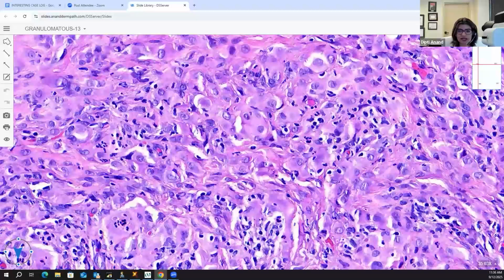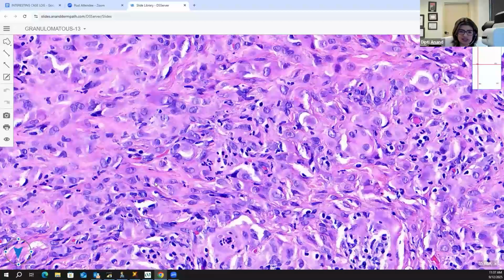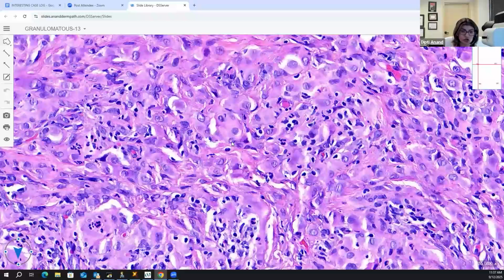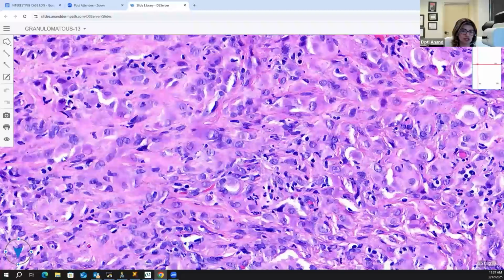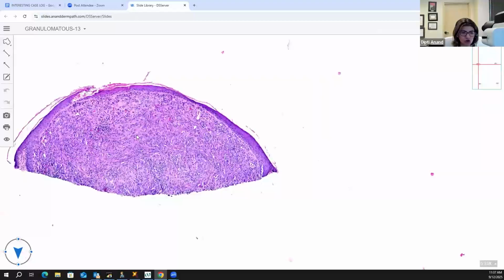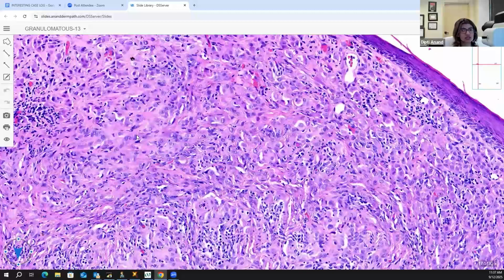These have very nice cells, and they are not really multinucleated. They are more like binucleated. Maybe they may have three nuclei, but they're not big multinucleated like the xanthogranuloma. And then this is the nice dense amphophilic cytoplasm. Yeah, that's your reticulohistiocytoma. And then plenty of second order questions, right? Multicentric reticulohistiocytosis, paraneoplastic manifestations, association with autoimmune disease, progressive destructive arthropathy. There's so many questions they can ask you. So a lot to know theoretically.